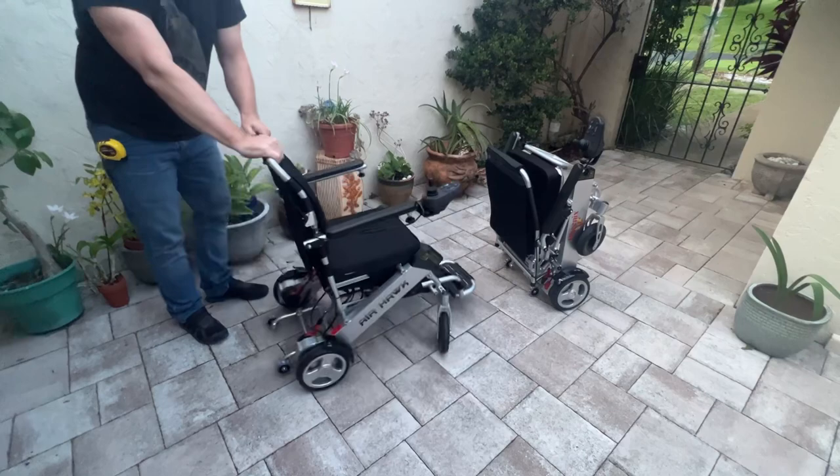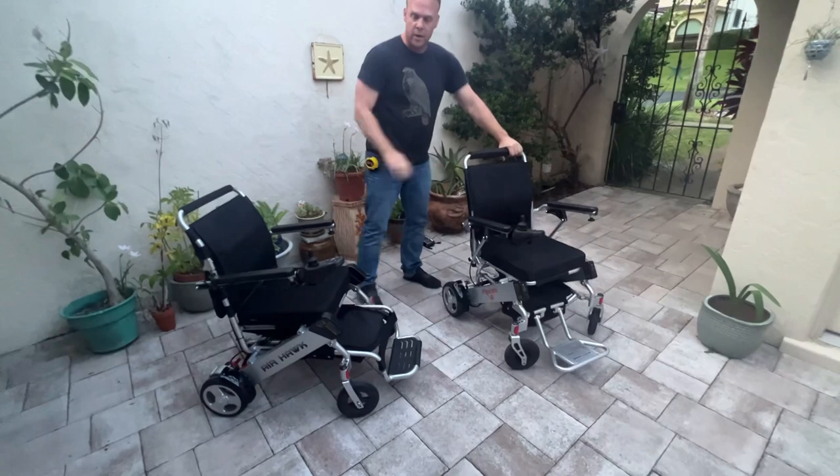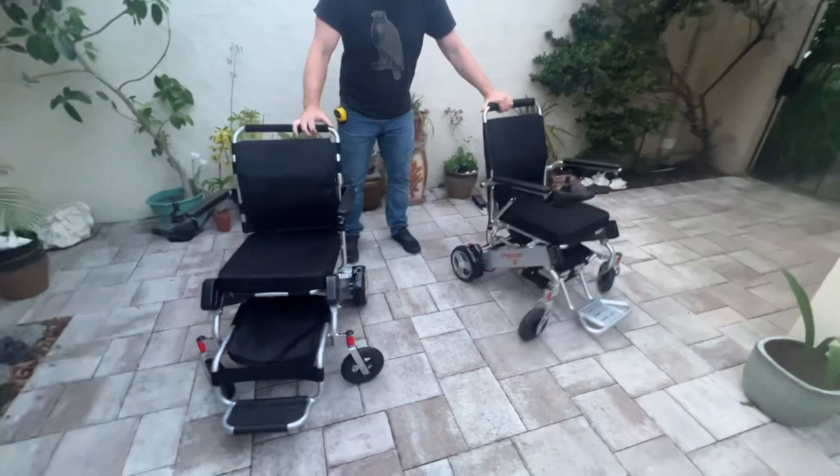Now let's unfold the Phoenix. That's it — it's done, it's unfolded, it's ready to go. So let's take a look at both of these chairs side by side and compare how you would get in the chair.